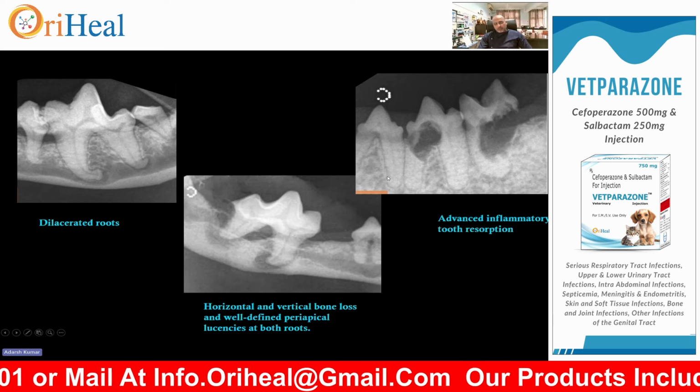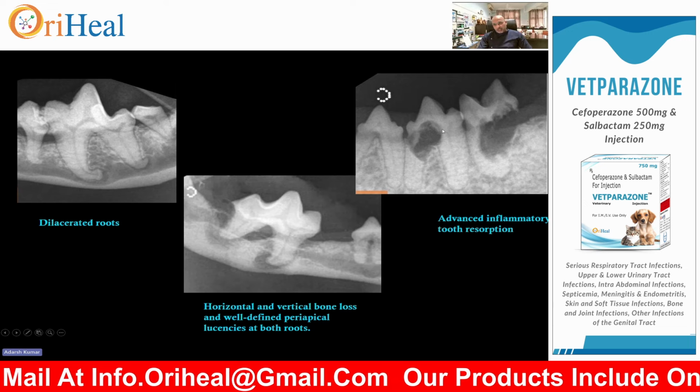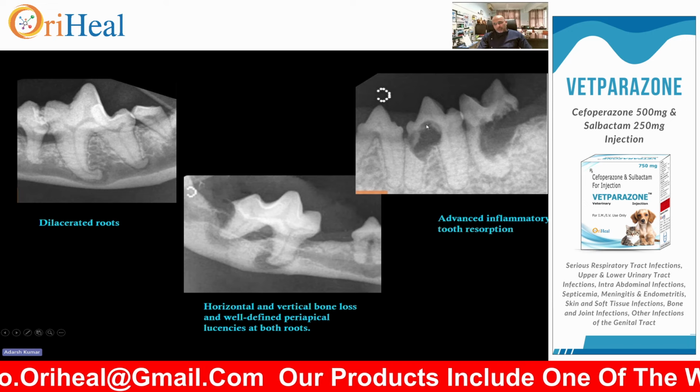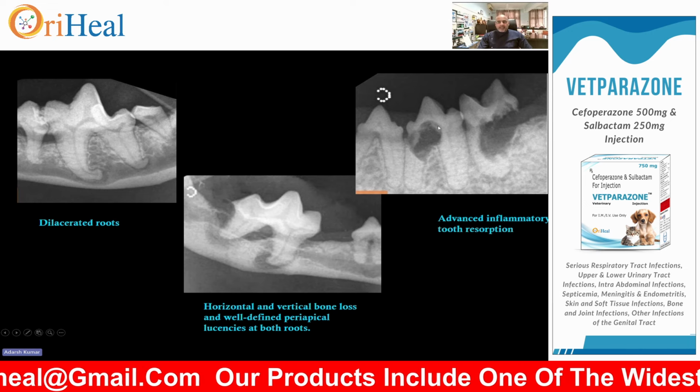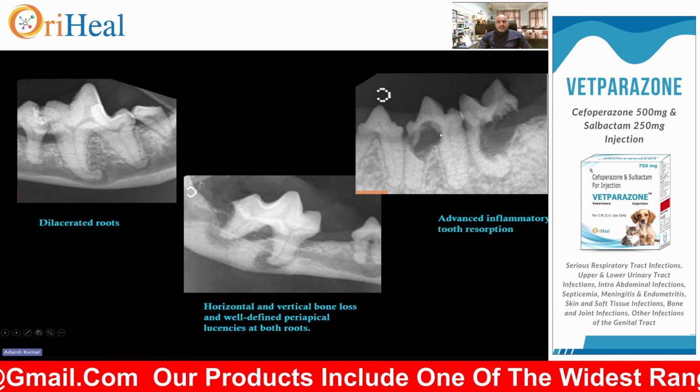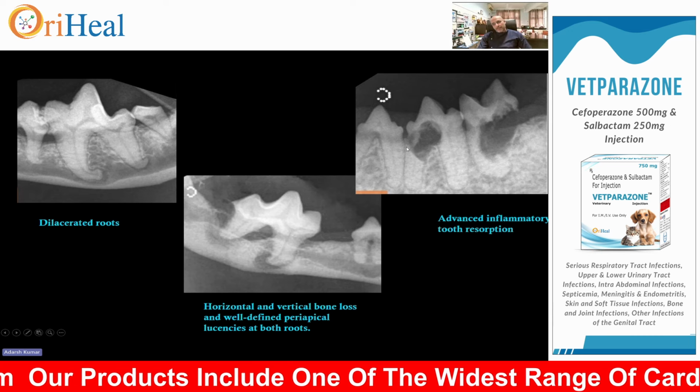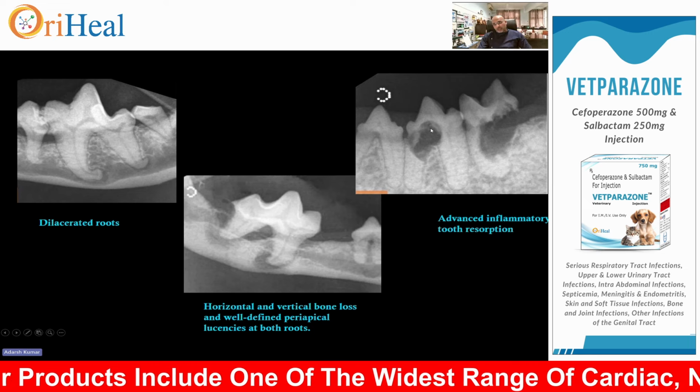If we find such kind of deviation on the root, this tooth has to be extracted out. Now, here is an inflammatory tooth resorption. That means type 1 in cats, the dentine and the tooth substance is being eaten up. It is in the process of resorption. Now, this tooth has to be taken out.